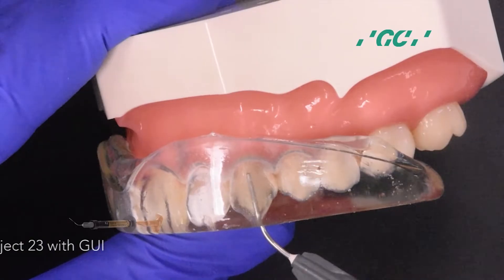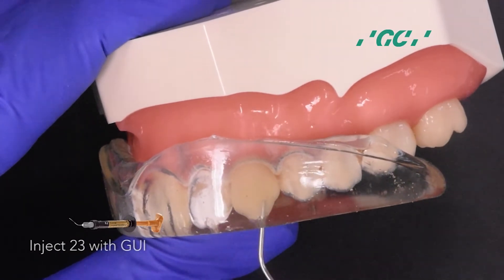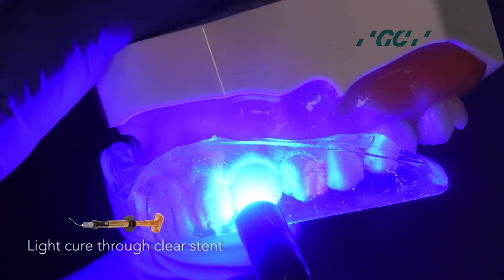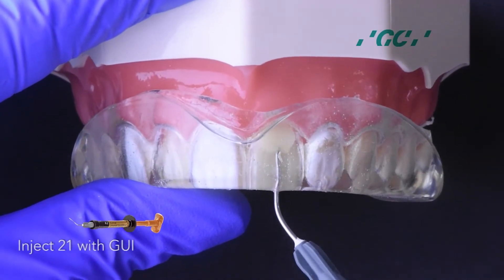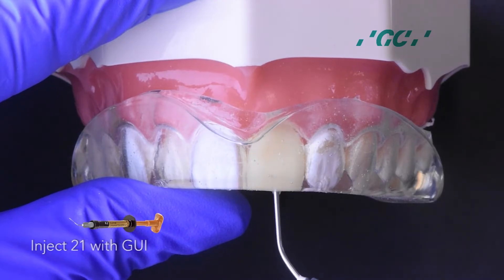Start injection molding on 2-3 with G-Aneal Universal Injectable Composite. This composite is a universal restorative displaying exceptional strength, aesthetics, and uniquely high thixotropic viscosity. Inject 2-1 with G-Aneal Injectable Composite, then light cure.